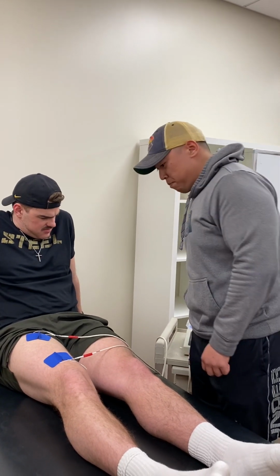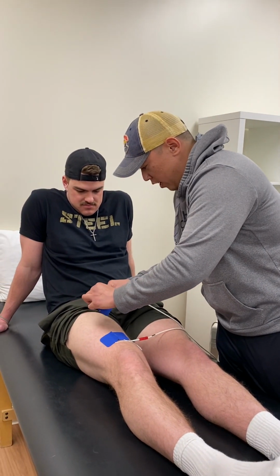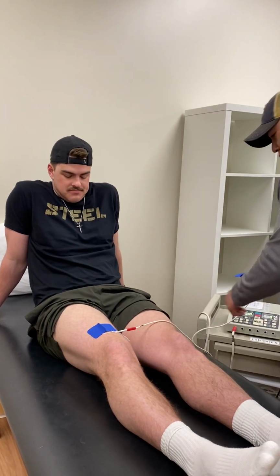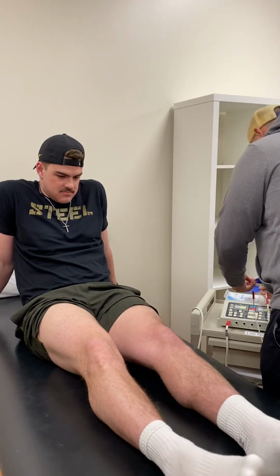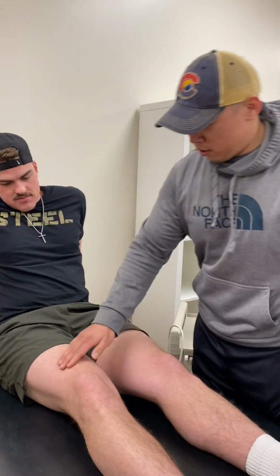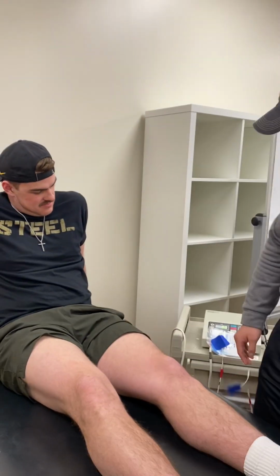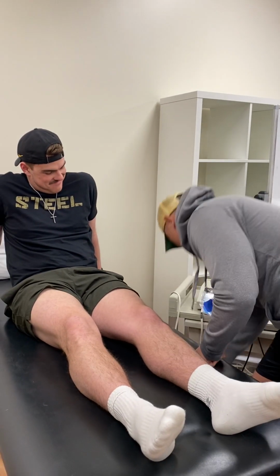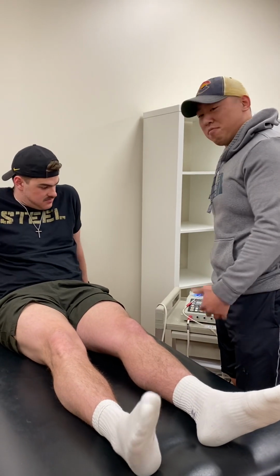I'm going to press stop. Take these electrodes off of him. Did everything go well? I'm going to inspect the skin afterwards. All right, everything looks good. You can still feel perfectly fine. Yep. All right, awesome. So that's what biphasic is.